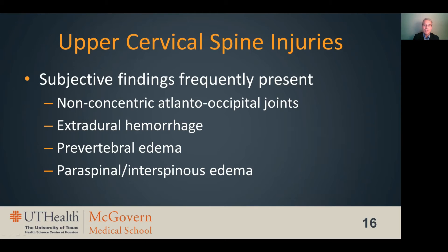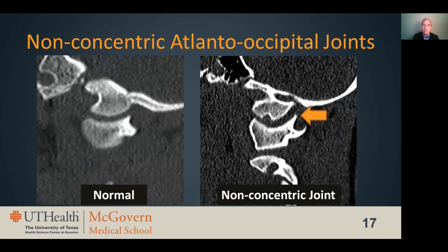In patients without gross malalignment, close inspection for subjective findings of cranial cervical injury can be very helpful in making the diagnosis. In our institution's study of pediatric patients with cranial cervical junction injuries, we found over 90% had at least one of four subjective findings. Non-concentric appearance of the atlantooccipital joints is a fairly common finding, present in almost two-thirds of patients. Because the head tends to slide forward in cranial cervical injuries, you will often see widening of the posterior aspect of the atlantooccipital joint compared to the anterior aspect, even when the joint space measures less than the 2.5 millimeter cutoff.